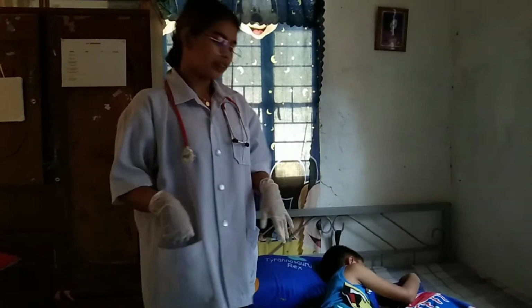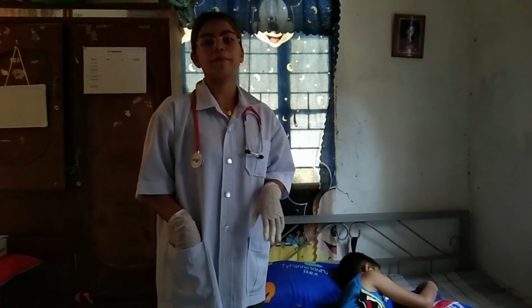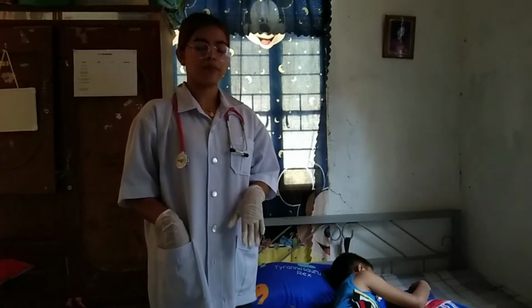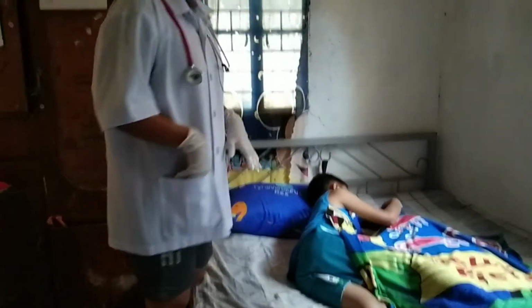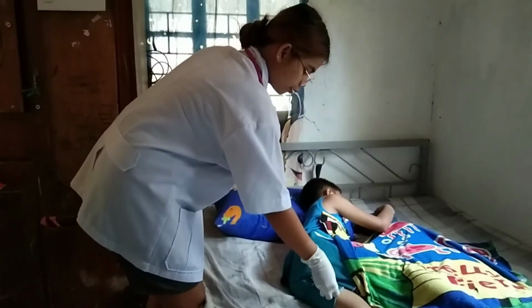Next, after inserting the thermometer inside the rectal part of our patient, we need to wait an approximate time to collect the temperature of the patient. So after collecting the temperature of the patient, we need to remove the thermometer from the rectal part.